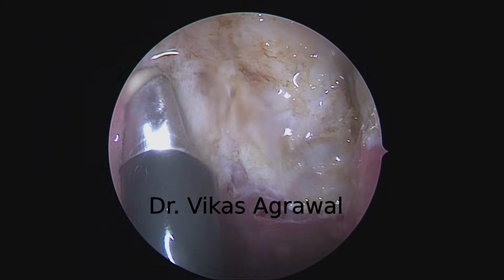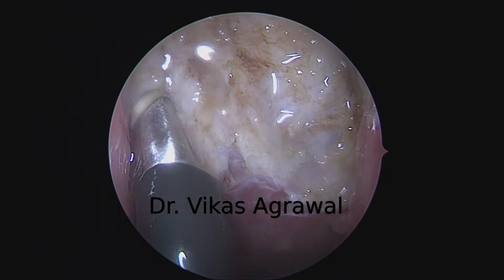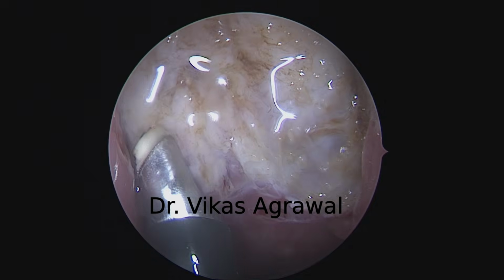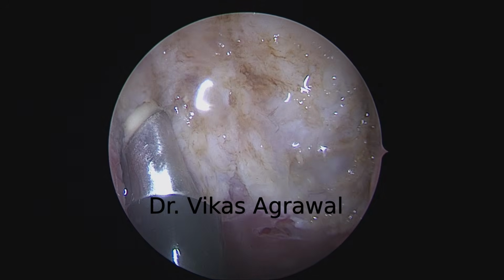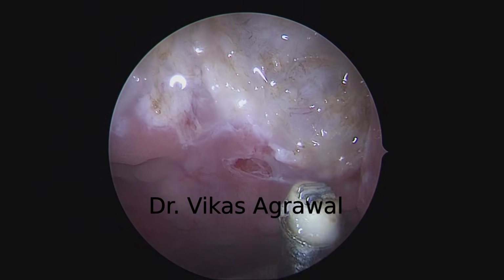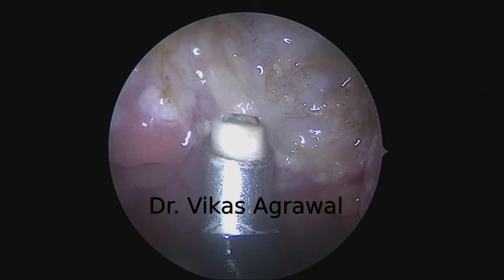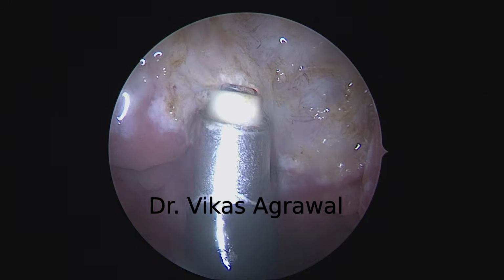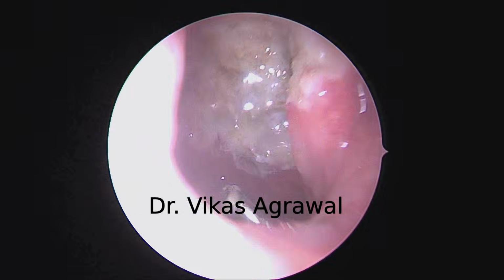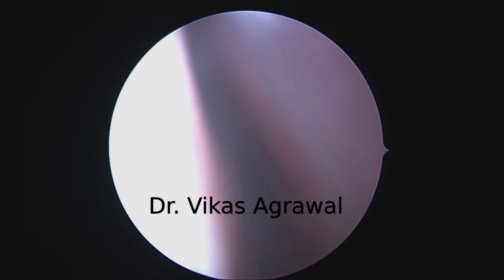Now, I may have to go in from the right nostril because I cannot see very clearly here. That's the fossa of Rosenmuller on the right side. Whatever is very clearly visible, I am doing. All right, that's our inferior boundary. Now, let me go in from the right side, right nostril. No significant deviation of the septum in this case.